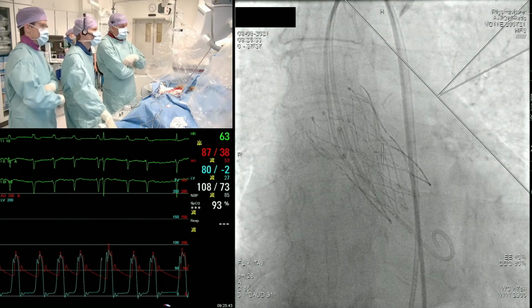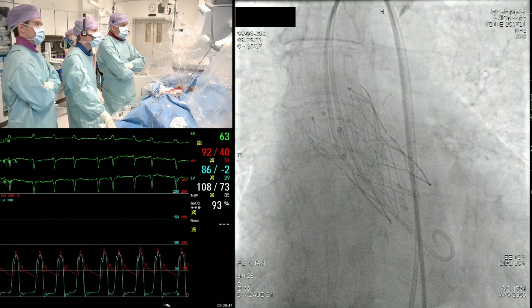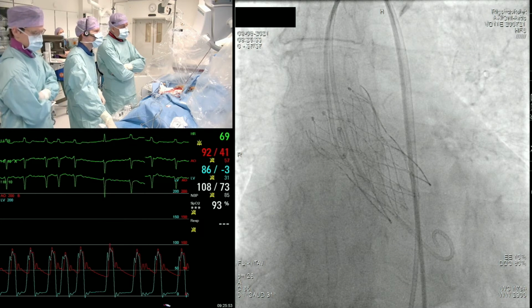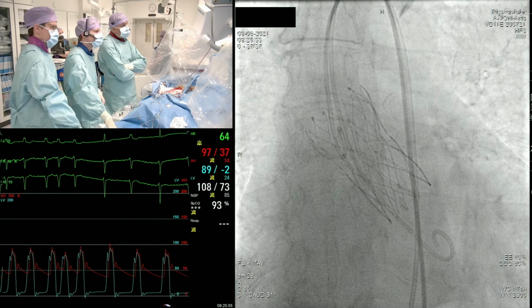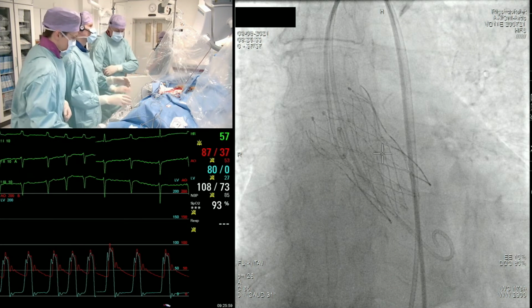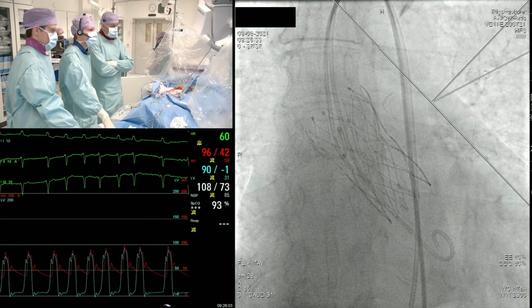If you look at the outflow part of the stent frame, you see you have one of the tabs positioned on the right-hand side of the screen, and the two other ones are almost overlapping on the non-coronary. It's not perfect, but it's close to be. We have definitely avoided that one of the commissural posts is in front of the coronary.